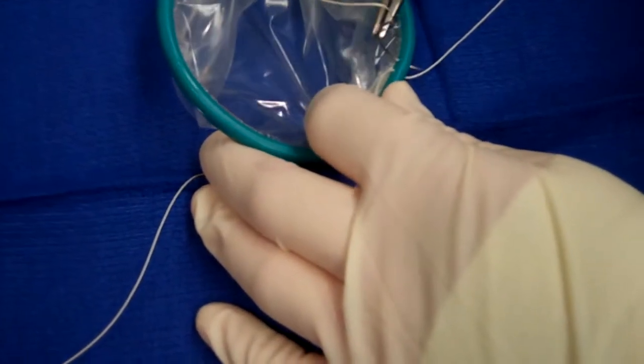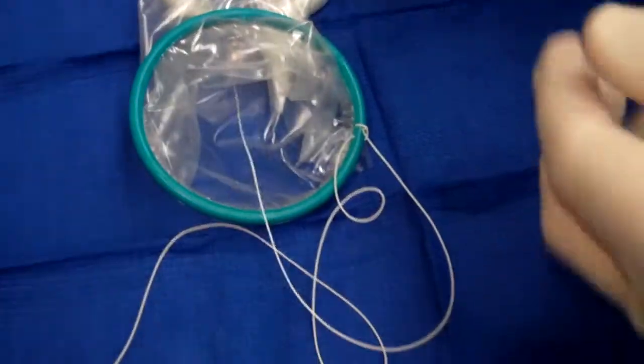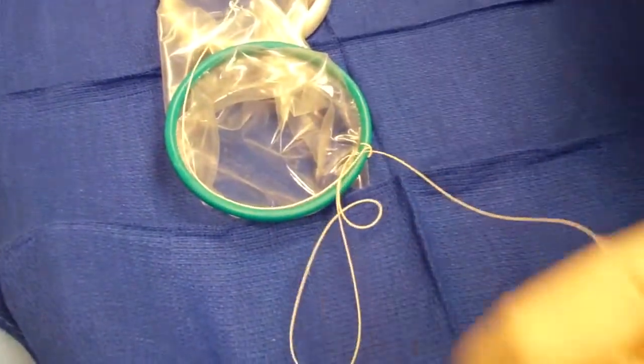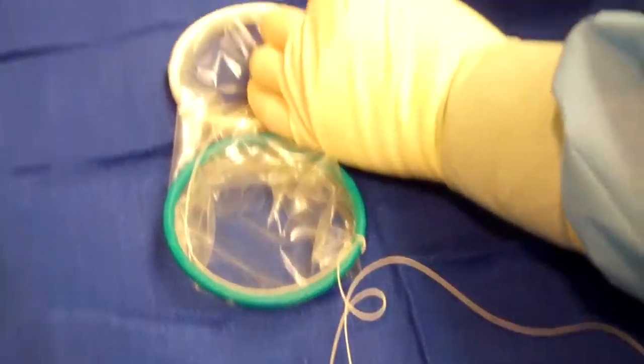Great. There we go. And then just tie a figure of eight. And then it's important to roll the tether back in after she ties it. Great. She'll cut off the needle. We don't need the needle.